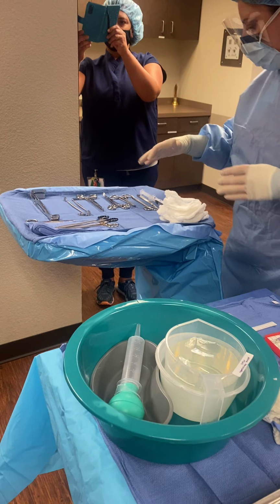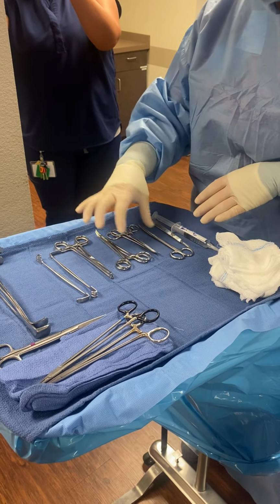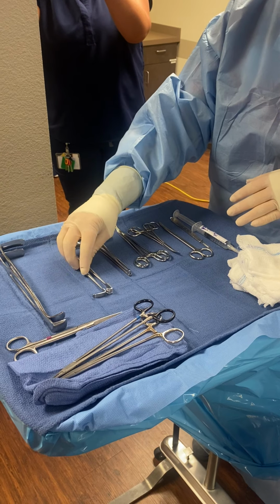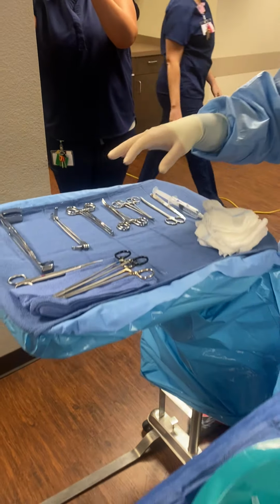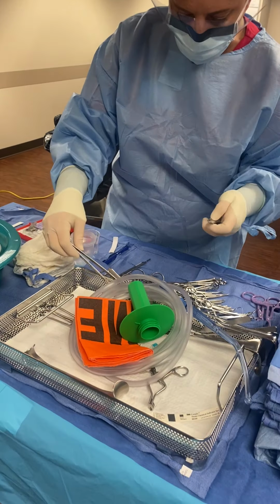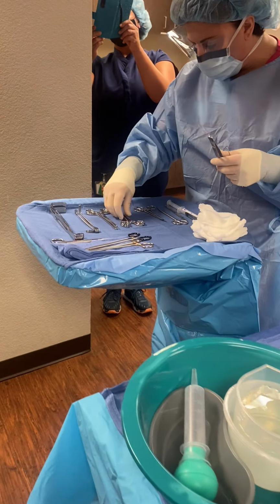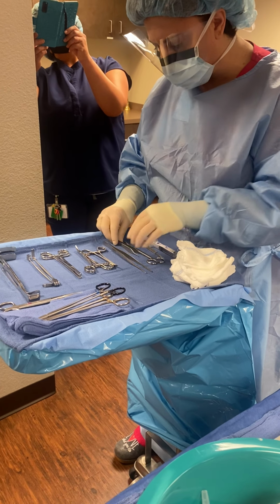So I have my local and my blade closest to me. I have a scissor, different types of hemostats, depending on what she might like, the Allis to grasp the mass, and a couple different types of retractors, Senns and Army Navies, and then I just need some forceps. So I'm maybe going to pull up a DeBakey and an Adson with teeth. Sometimes if it's a bigger breast, they might want a DeBakey. I like to keep them by my scissors, because usually when you pass the scissor, you're going to pass the forceps.